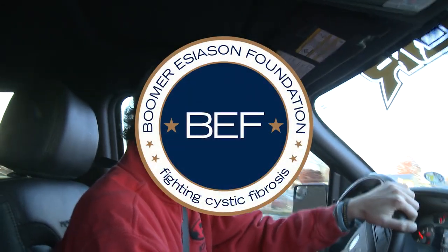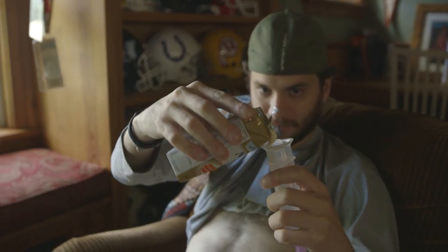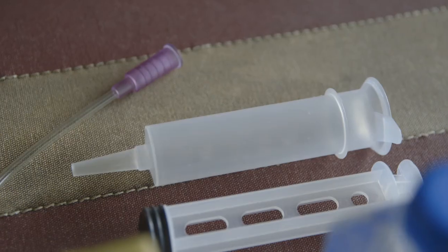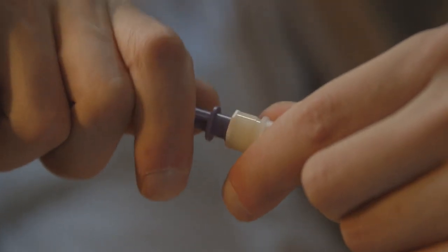This video, the first day home with a feeding tube, will show how easy it is to use a brand new feeding tube. I will also demonstrate how to use the new ENfit transitional system to connect a pump set to a feeding tube, but more about that in a minute.